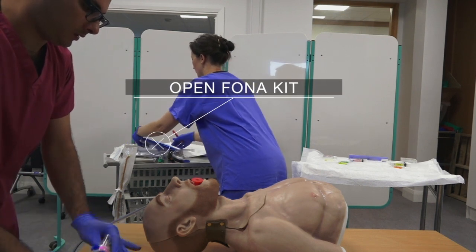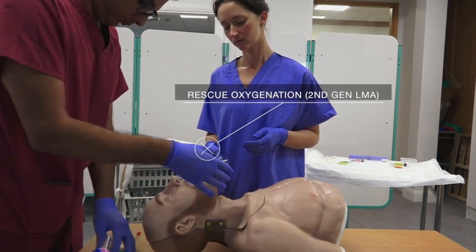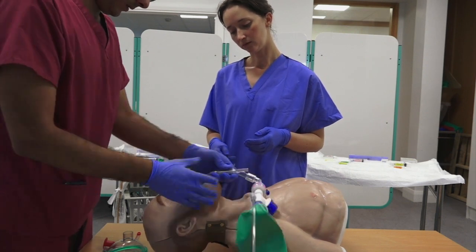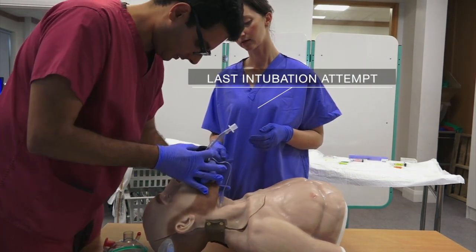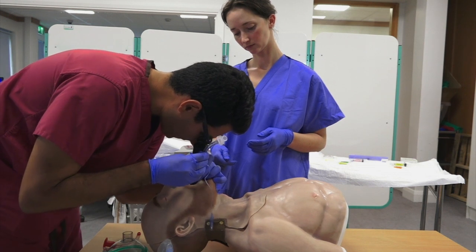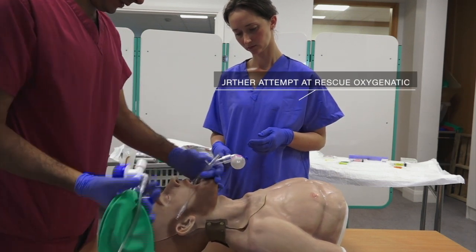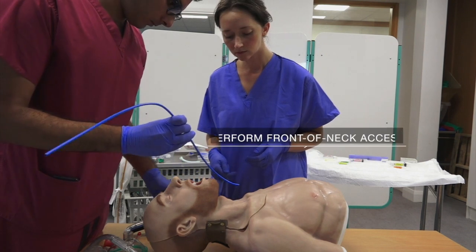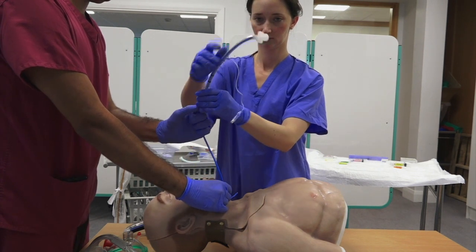Since intubation and face mask ventilation are proving difficult, ensure the front of neck access kit is open. Rescue oxygenation may be attempted with a second-generation laryngeal mask airway. Ventilation is still inadequate, so a third intubation attempt is performed using a video laryngoscope—this is the last allowable attempt. If a senior colleague arrives, they may attempt intubation one more time. All attempts at intubation have failed and rescue oxygenation has also failed. This is a can't intubate, can't oxygenate scenario. Consider waking the patient if possible; if not, we are forced to perform front of neck access.